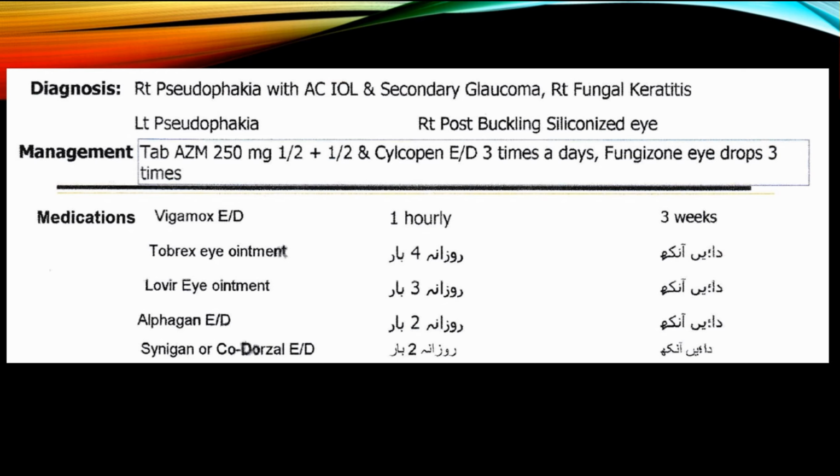And we'll see on his examination that the lid is swollen, and he's pretty distressed with it, and he complains a lot of photophobia. There's difficulty even opening his eyelids. Here you can see there's a central large corneal epithelial defect.